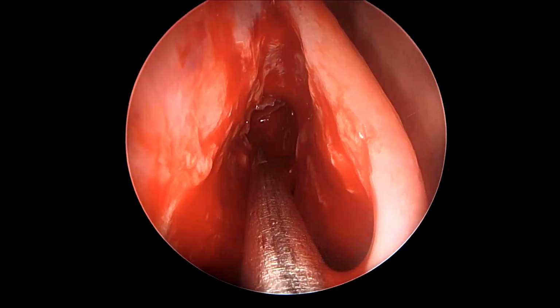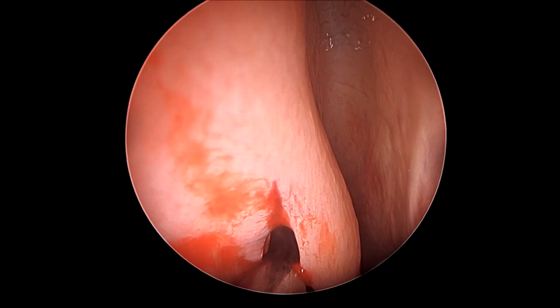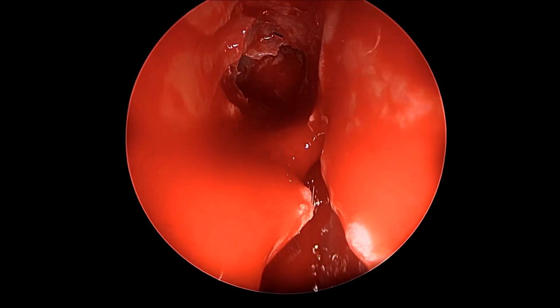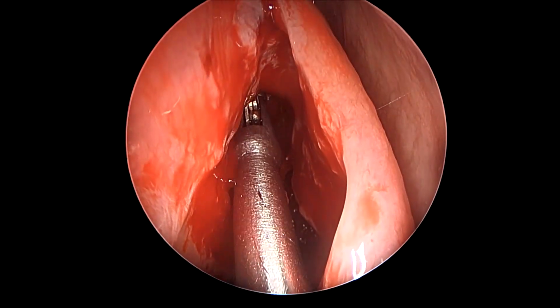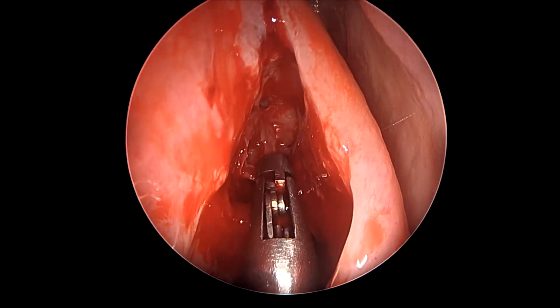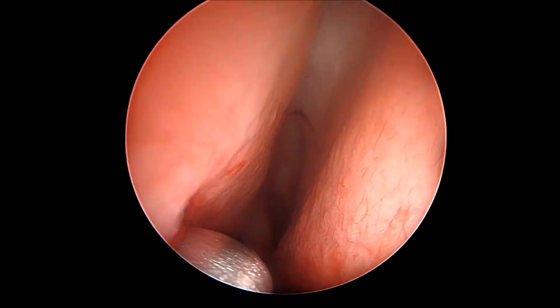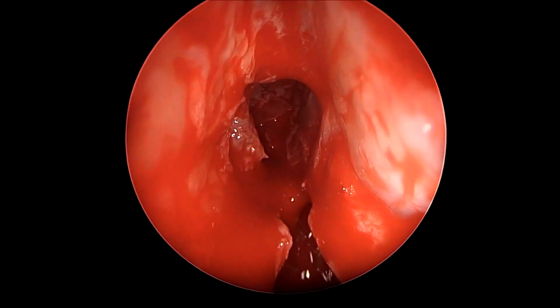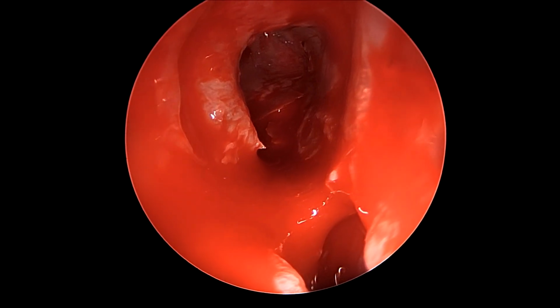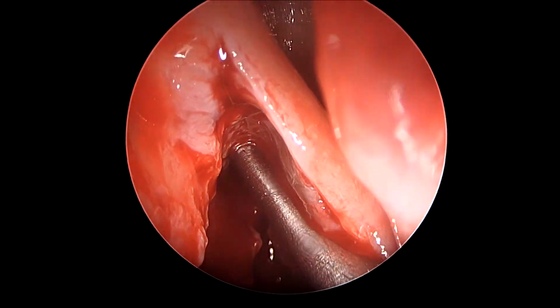We are just using here the frontal sinus navigation suction to locate our way inside the complex anatomy here. And we can see how the frontal sinus has been opened, and some excess bone and excess mucosa here can be gradually removed using a giraffe forceps. Once that is done, we see that the frontal sinus has been opened, though some excess mucosa is there that still needs to be trimmed a little.